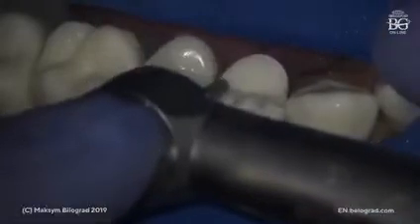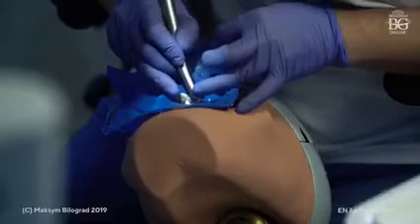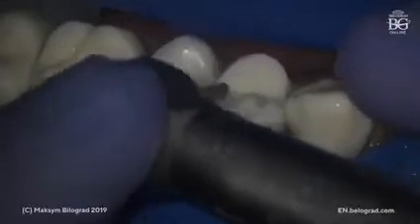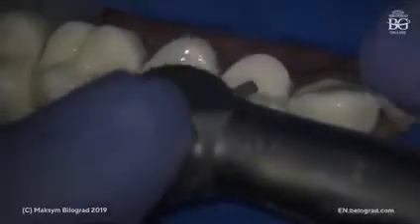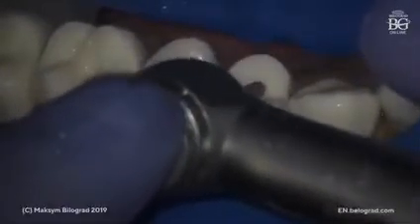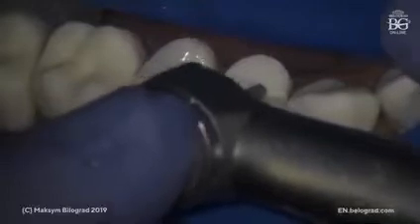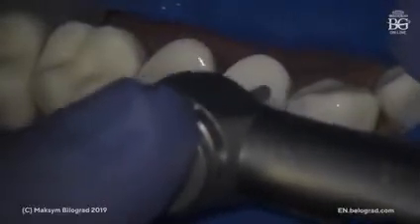Okay, then we will turn our burr towards the buccal surface and do the same here. Try to make your preparations and your movements more smooth and continuous. Don't make rough preparations, just make your movements smoother. So you will spend less time during the second stage of preparation if your preps at this step are smooth.